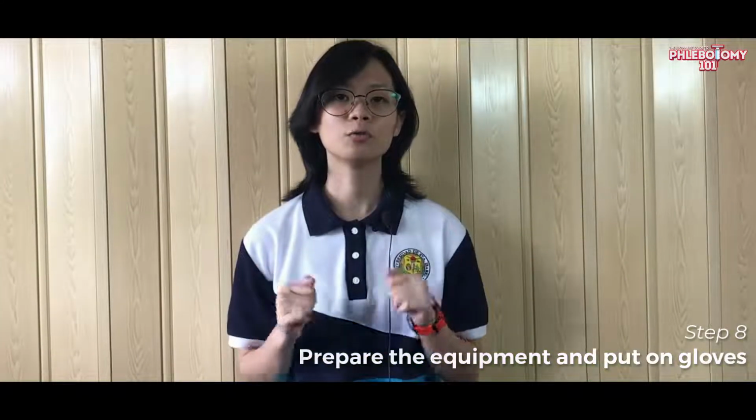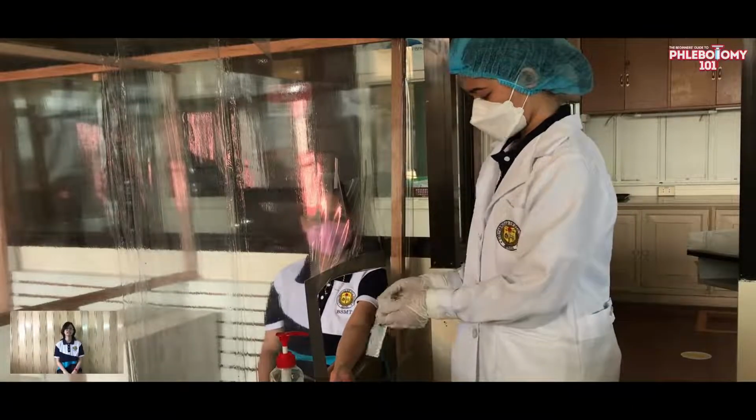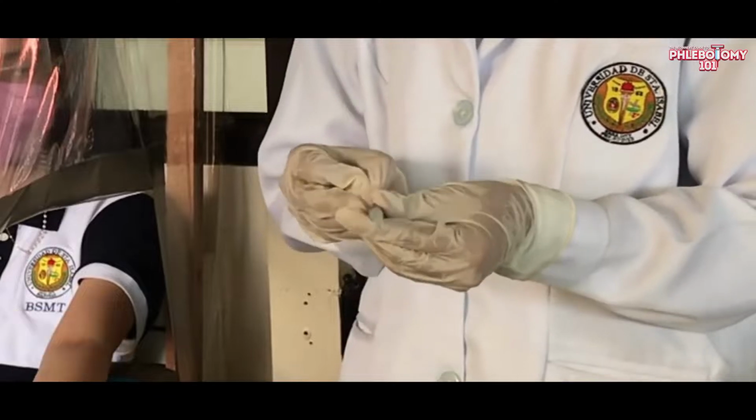In this video, we will be doing the venipuncture procedure using the syringe system, so it is very important to select the appropriate syringe and needle. Open the package aseptically and securely attach the needle to the syringe, and then you have to test the plunger.